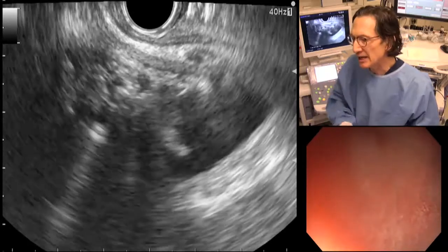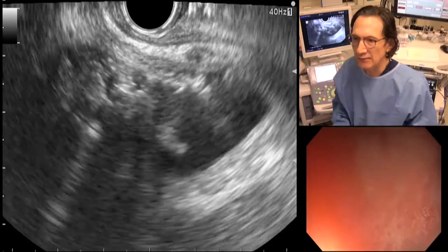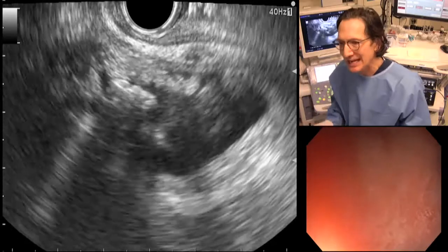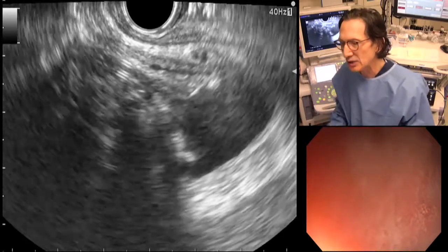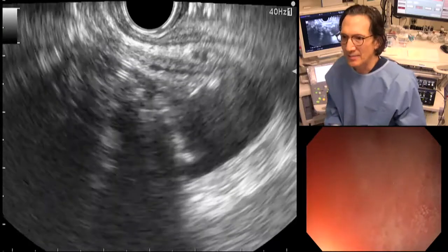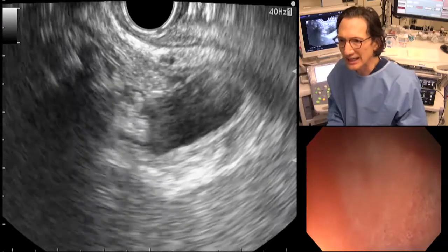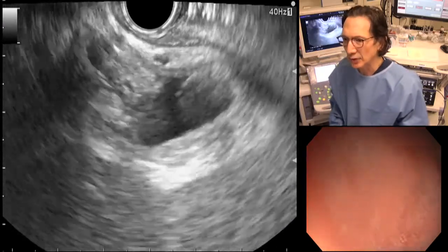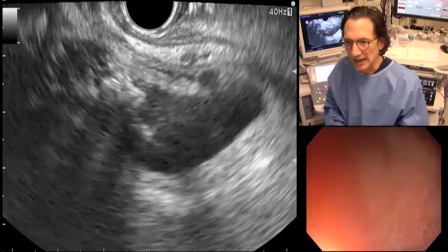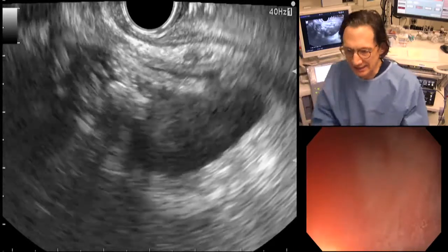Now, we're in an X-ray room, and we certainly could also inject contrast and fill the gallbladder with contrast. We're not leaded here because we don't intend to use X-ray, because I don't know of a reason to use fluoroscopy at this time. But certainly, it's an additional imaging modality that can be beneficial. And if there's an indication, then we absolutely will put on our lead and use X-ray. So the patient's on the X-ray table. We have X-ray available if we need it.